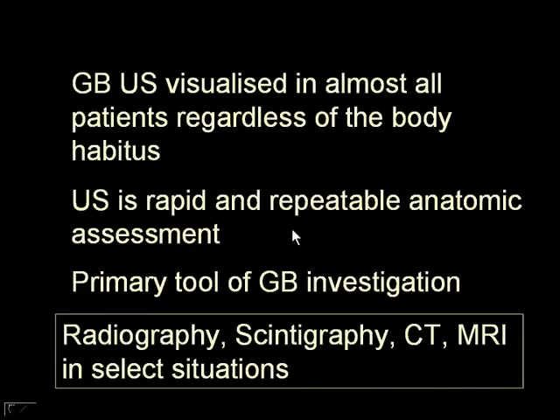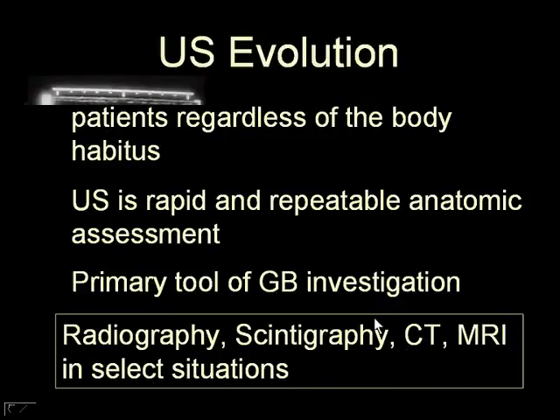So the gallbladder is ultrasonically visualized in almost all patients regardless of body habitus. Ultrasound is a rapid and repeatable anatomic assessment. It's the primary tool of GB investigation. The other tools are all there, but yes, ultrasound is the primary tool and it's a tool to stay.